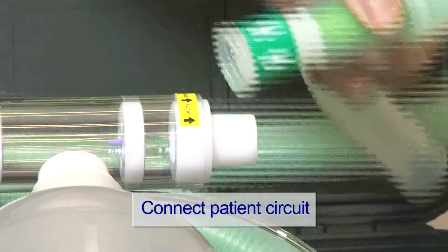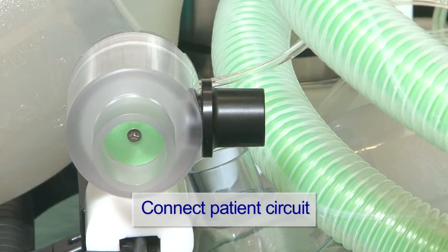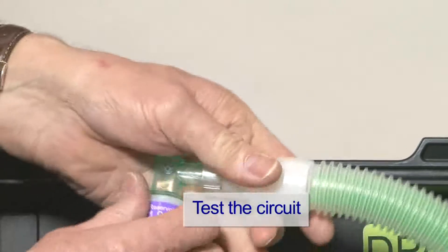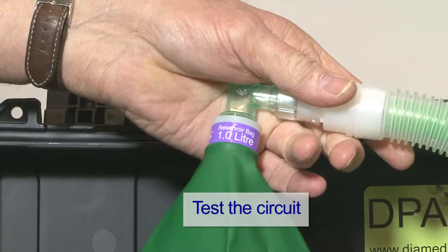Connect the patient circuit first to the outlet of the clear valve section, and then connect the other limb to the expiratory valve. Test the circuit is complete by using a test lung or a one-litre bag.